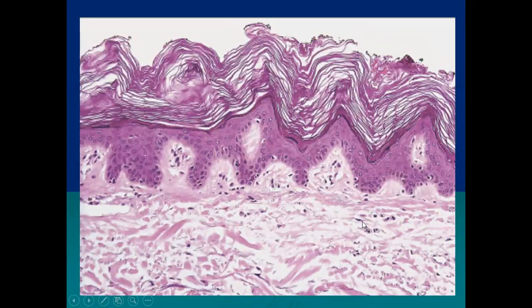The image you are seeing now is that of hyperkeratosis, but in addition to hyperkeratosis, another feature which is noticeable is the tenting of the epidermis upward, like a church spire, like the minarets of a church. They are conical like this, and this is also known as papillomatosis.